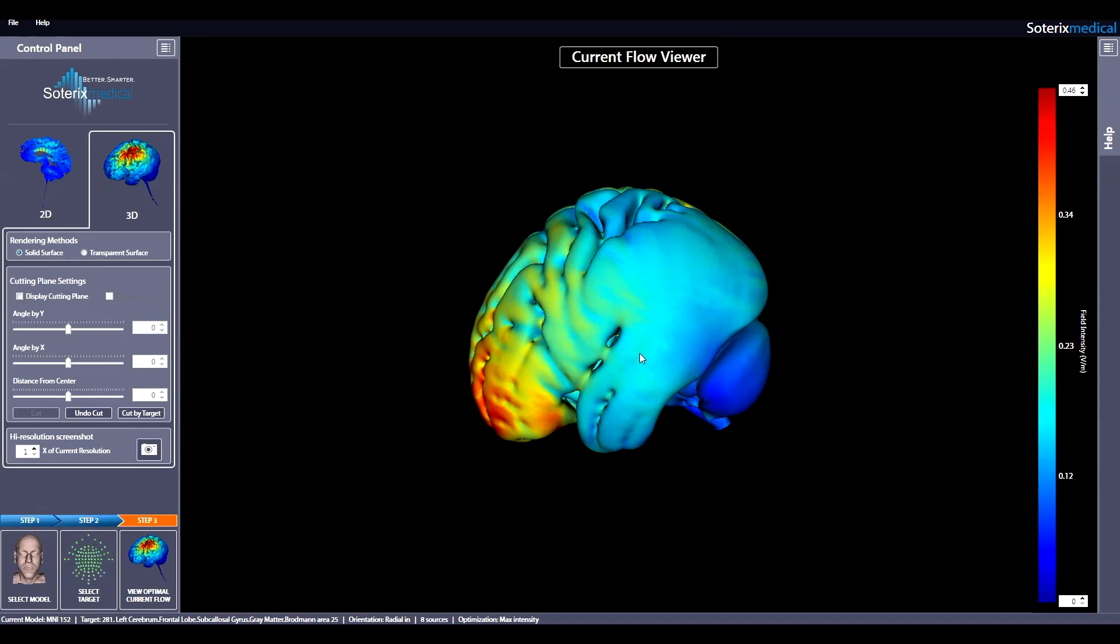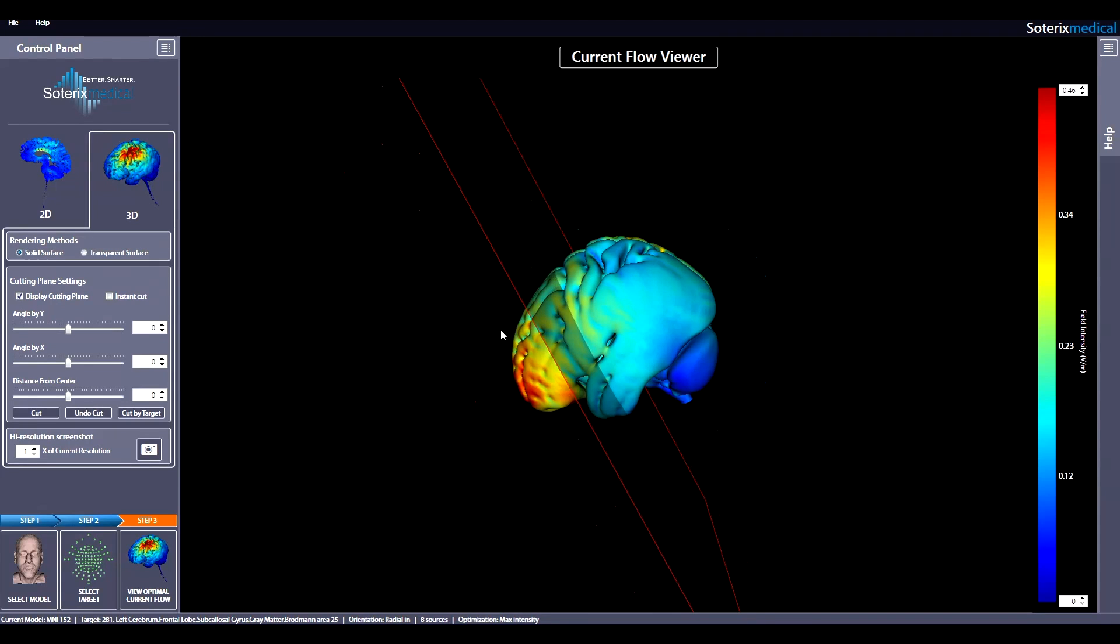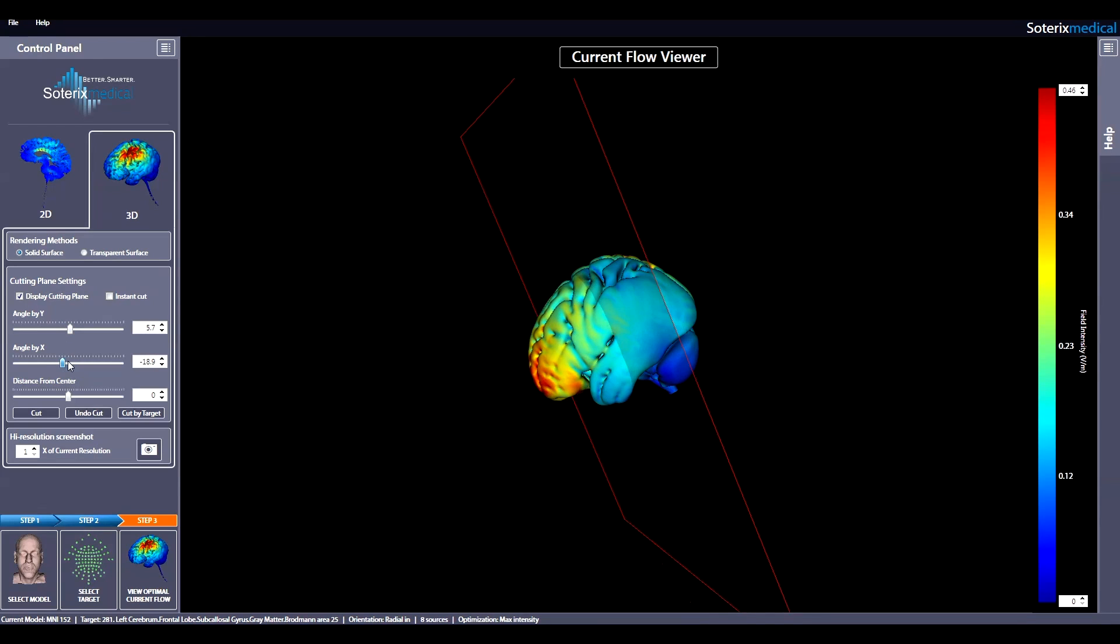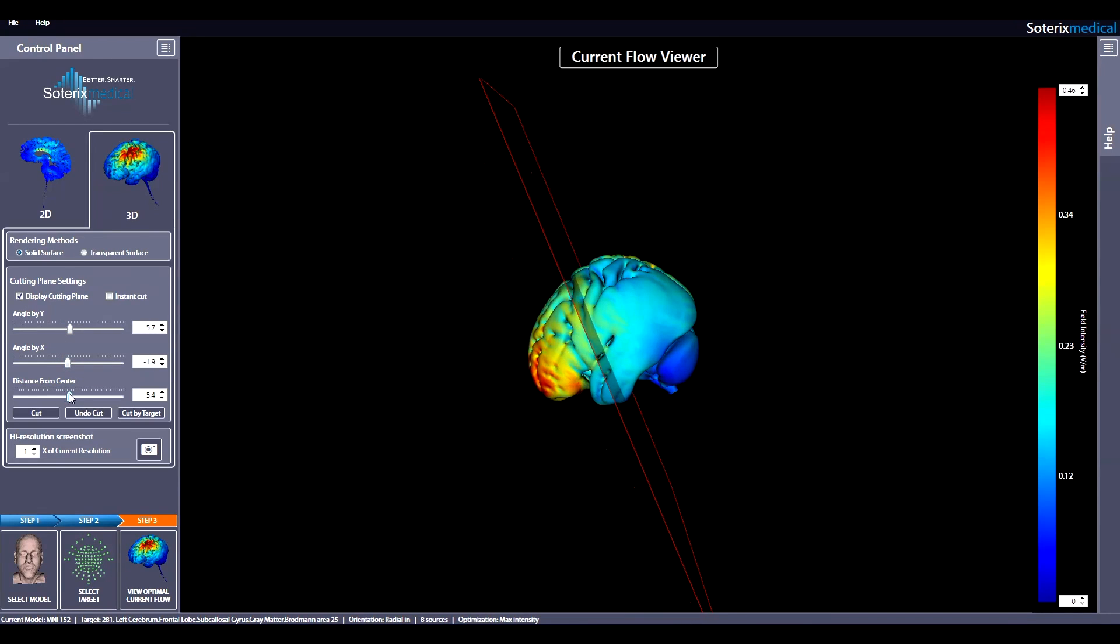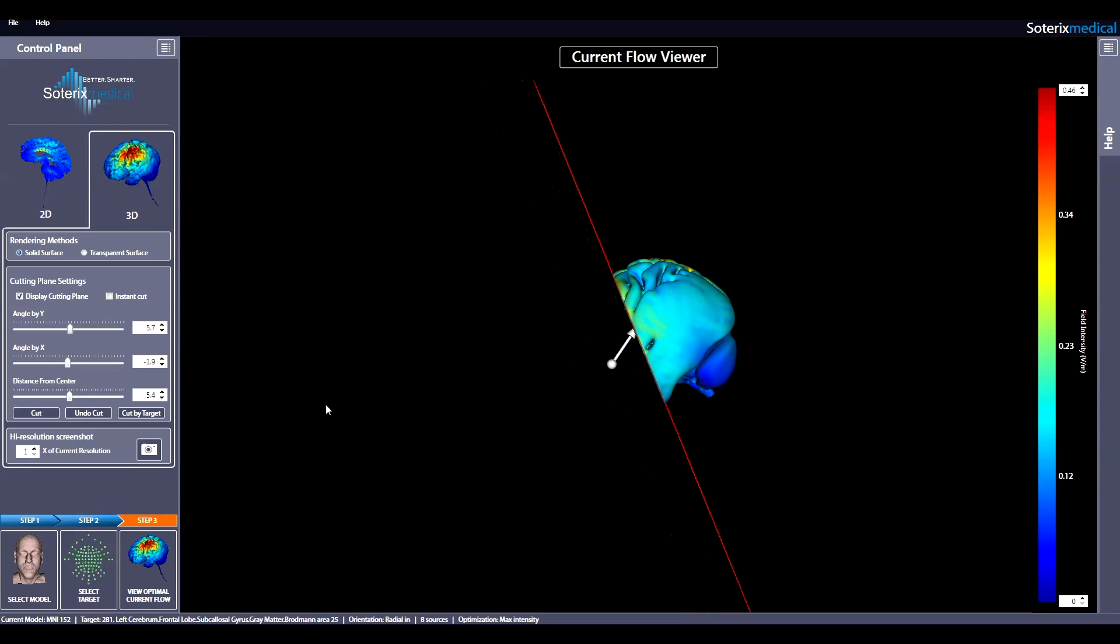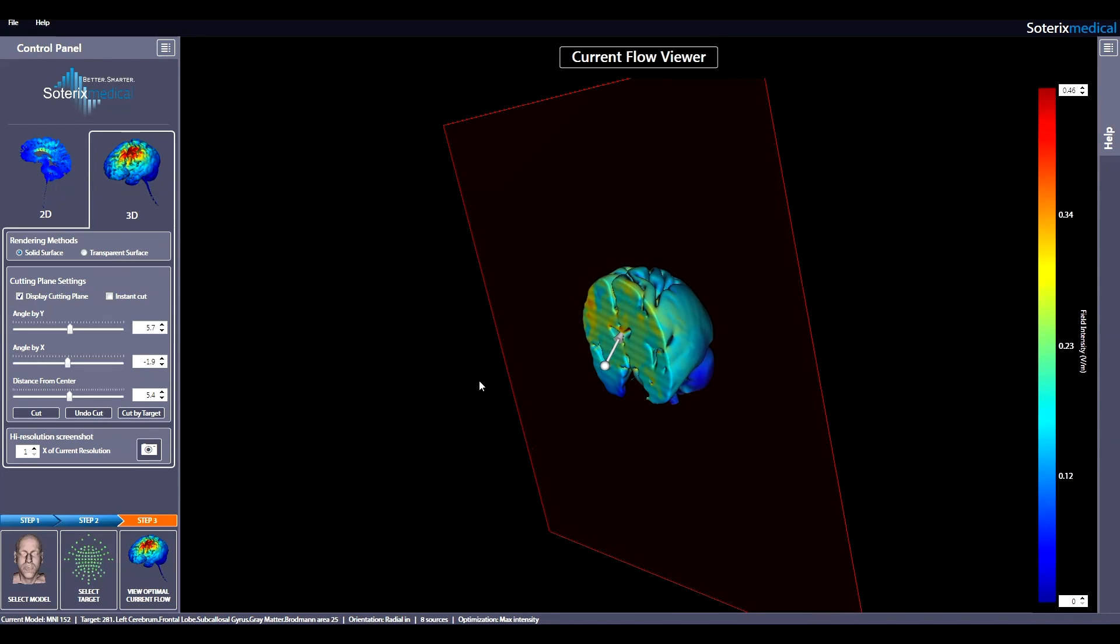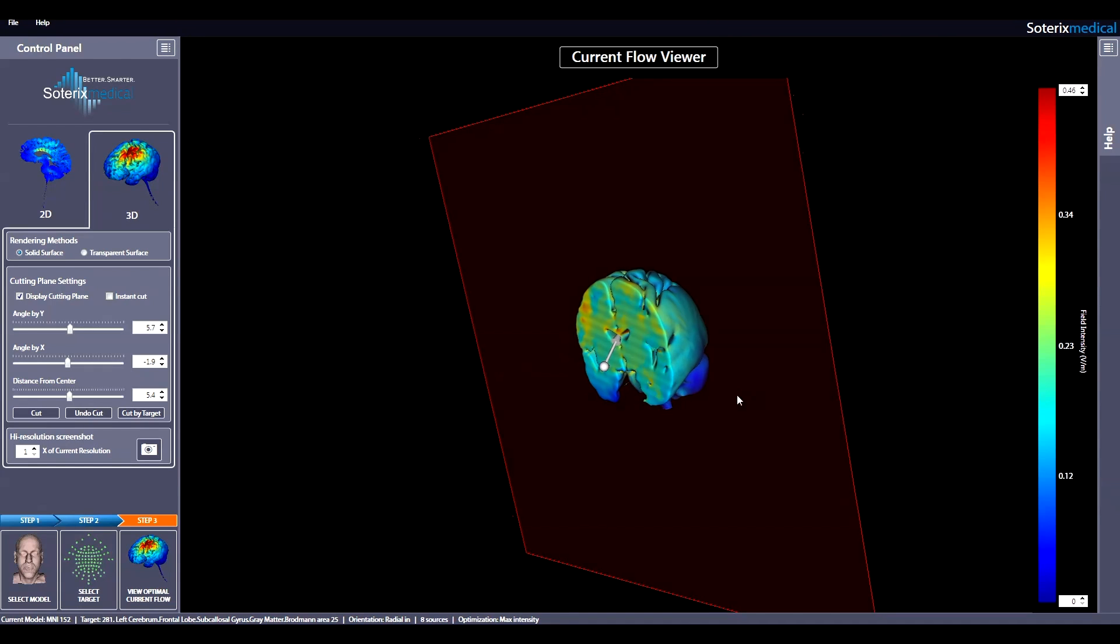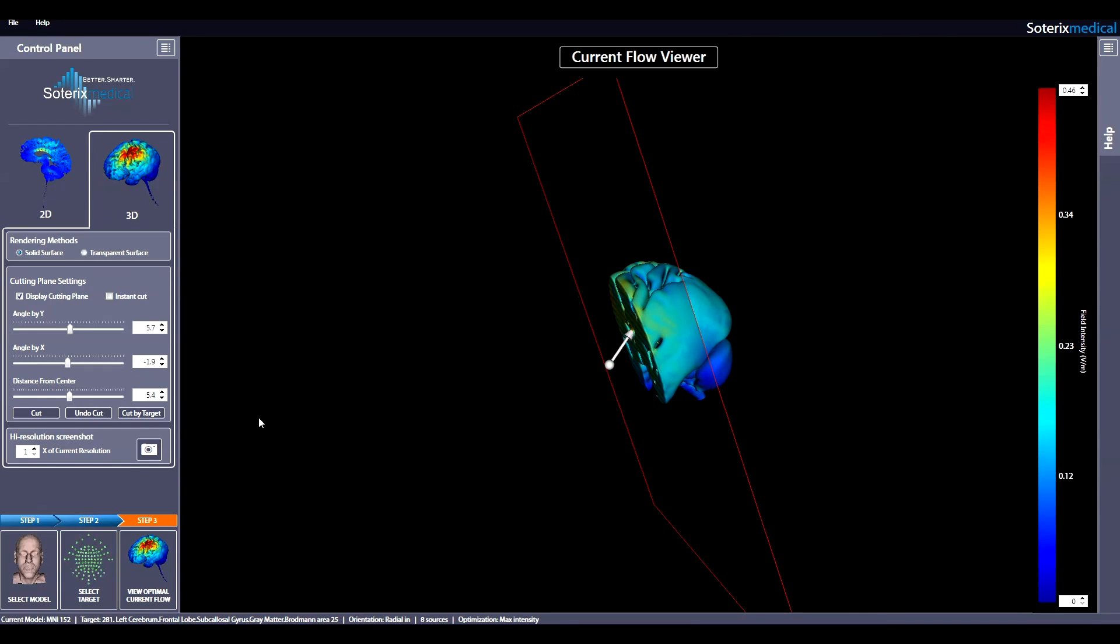By clicking display cutting plane, a plane will be shown in the rendering. The x and y value as well as the distance from the center of the plane can be adjusted using the sliders to define a precise location. To cut the 3D volume at the plane and explore current flow inside the head, simply click Cut, and the head will be cut at that plane. If you want to undo the cut, just click Undo Cut.